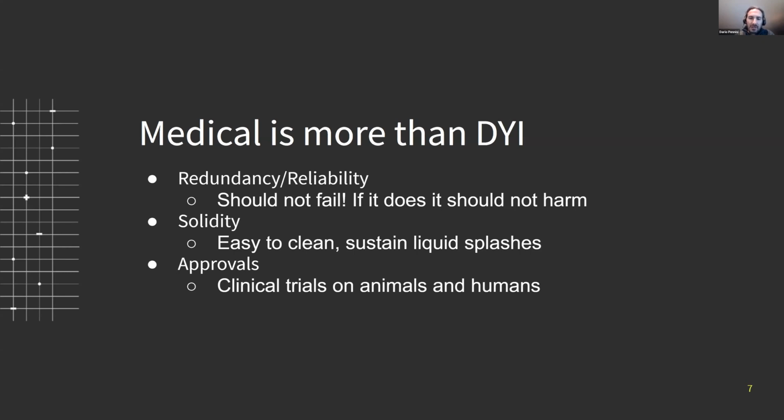And of course, if you have a sensor, probably you need at least two or three, because something can break. Remember that ventilation means moving air in and out, probably one time a second, or one time every 2 seconds. So there is a lot of stress on every mechanical part, and this should be up there for quite a lot of time. Also, it must be solid.